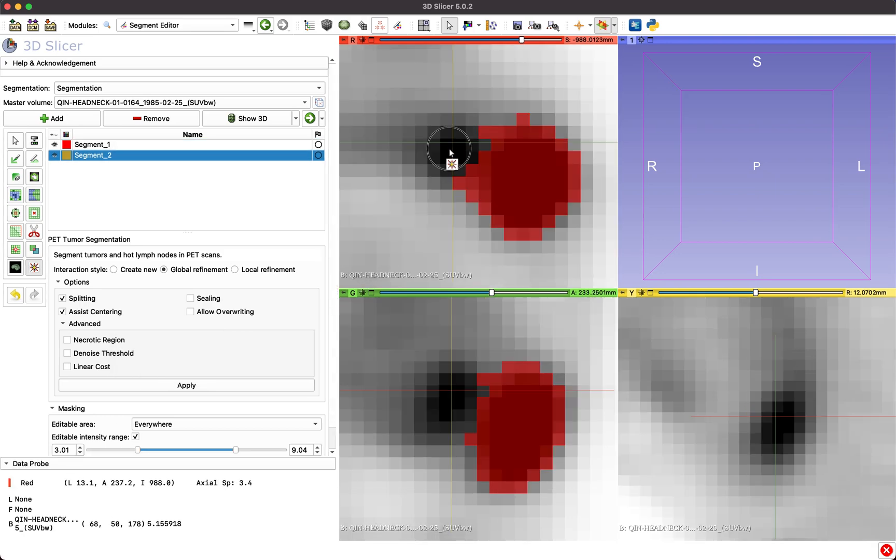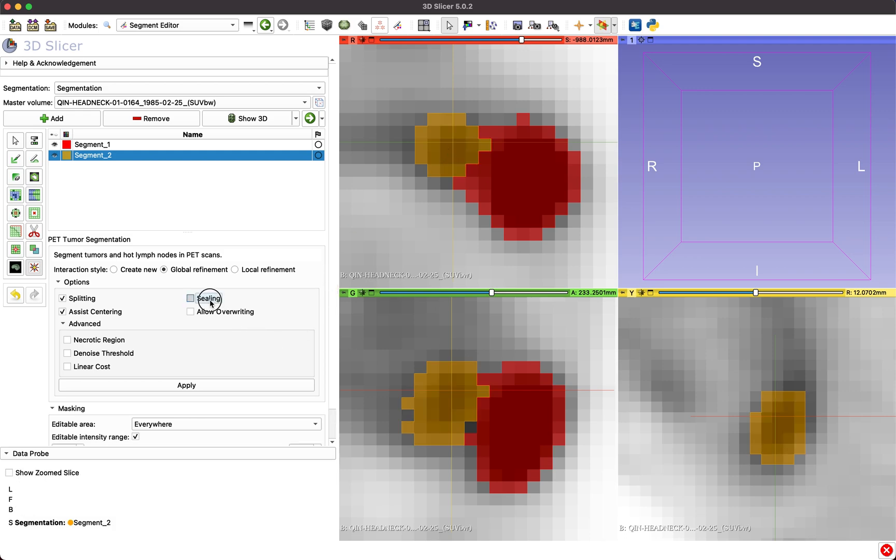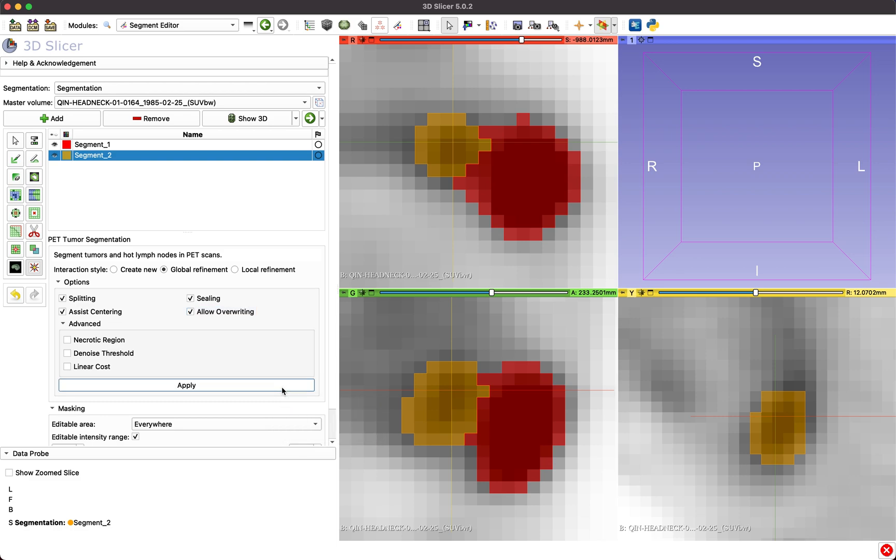Sealing and Allow Overwrite affect the behavior in cases when another already segmented lesion is nearby. Sealing closes single voxel gaps between the current segmentation and other objects.